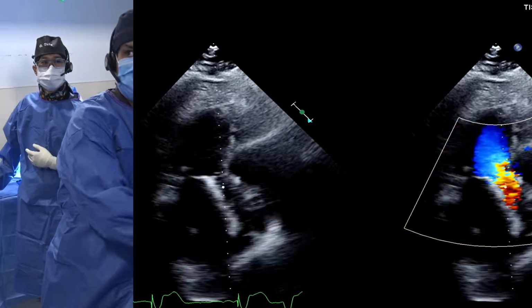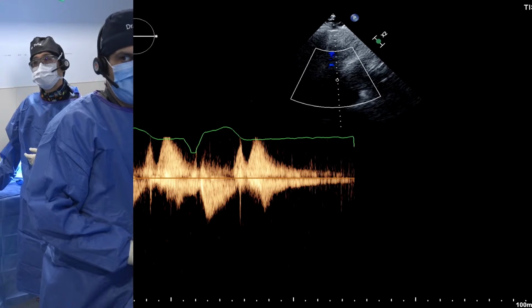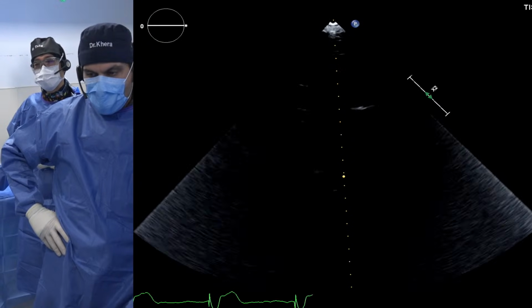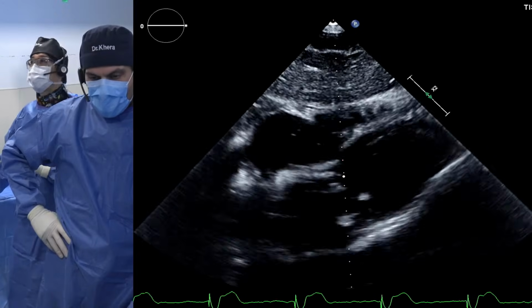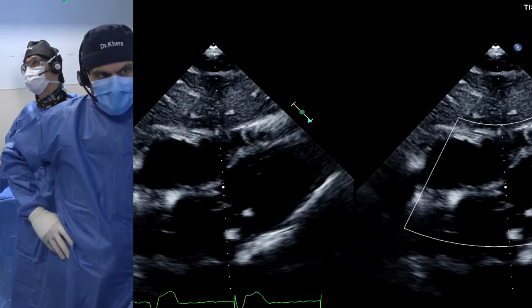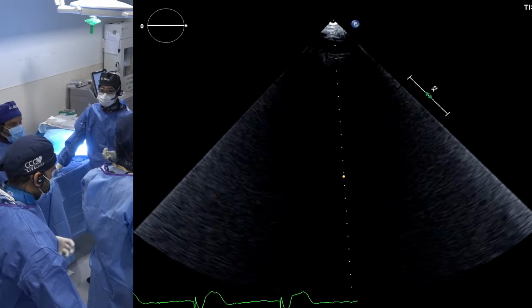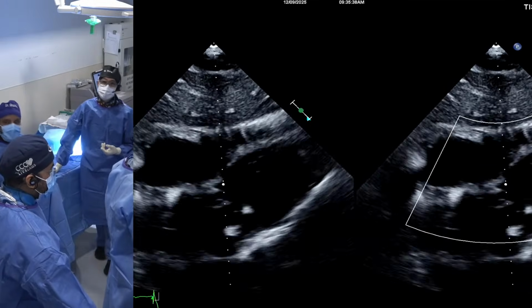But there's another novel technique which people have described in some case reports. What you do is, through electrocautery, go through the leaflet of the aortic valve in the patient with aortic regurgitation. And once you have that, deploy your valve, and now it's not going to move anywhere. The technique is basically interesting. It's called the unicorn. You do an intra-leaflet disruption and deployment, and it's only used for balloon-expandable valves, because that is the most practical. And of course, you still have to size appropriately. But yes, that has been described as well.